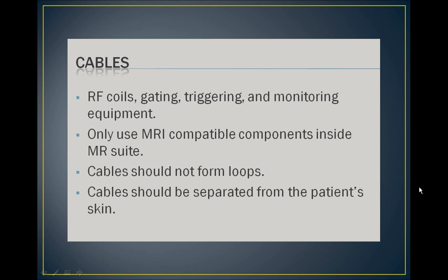It is very important that when positioning a patient for an MRI, the cables do not come in contact with the patient's bare skin. You can insert a pad between the cable and the patient or wrap the cable in a sheet or pillowcase to prevent this from happening. If a cable has direct contact with the patient's bare skin, burns to that area may occur.